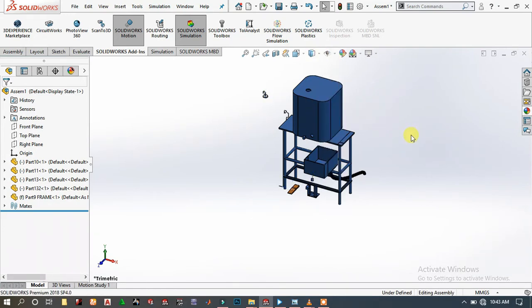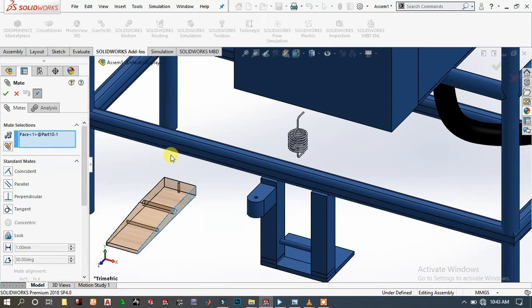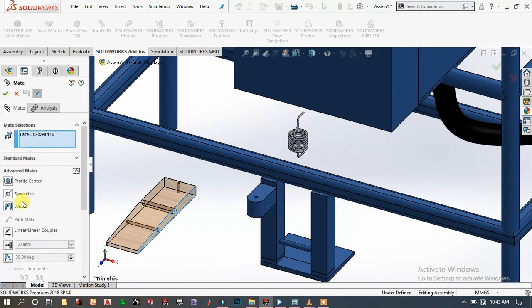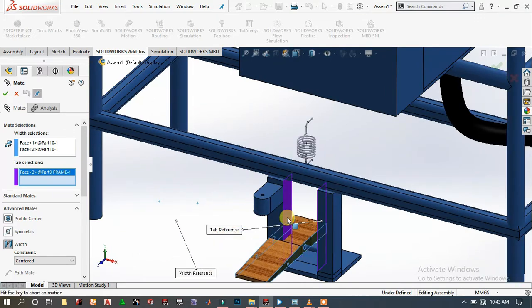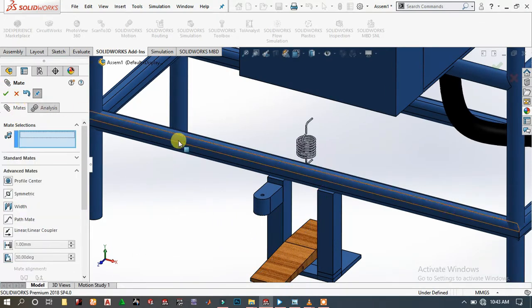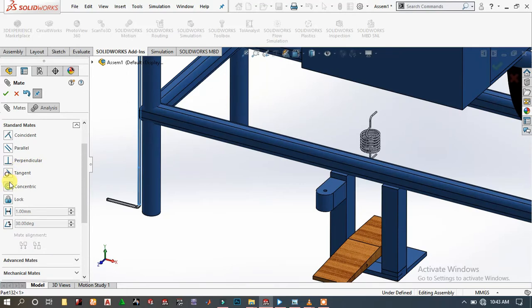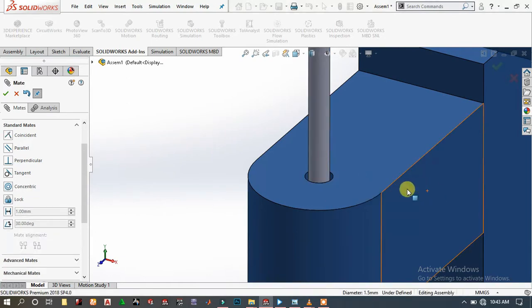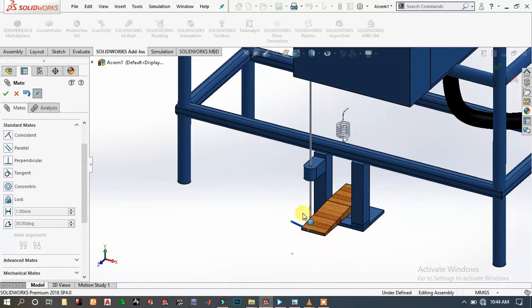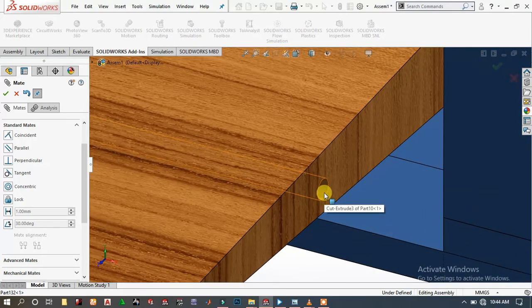Hide this origin point, then choose this face and mate. Scroll it down, go to advanced mate and choose width mate. Again, this opposite face, this face and the corresponding face, then click OK. And here we have to go to standard mate and choose concentric mate, choose this circle, then click OK. Again, choose this face and this inside circular face and click OK.